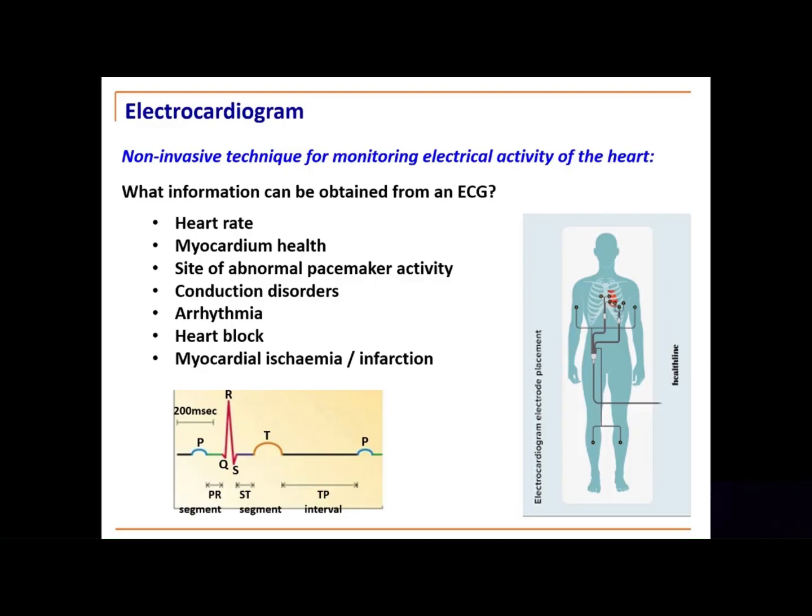What is the myocardium health like? So thinking about that, can we see abnormal pacemaker activity? Do we see arrhythmias? Do we see ectopic sites? So that just means, are we getting rhythms from the wrong place? Are we getting conduction disorders? Have we got blockages somewhere?